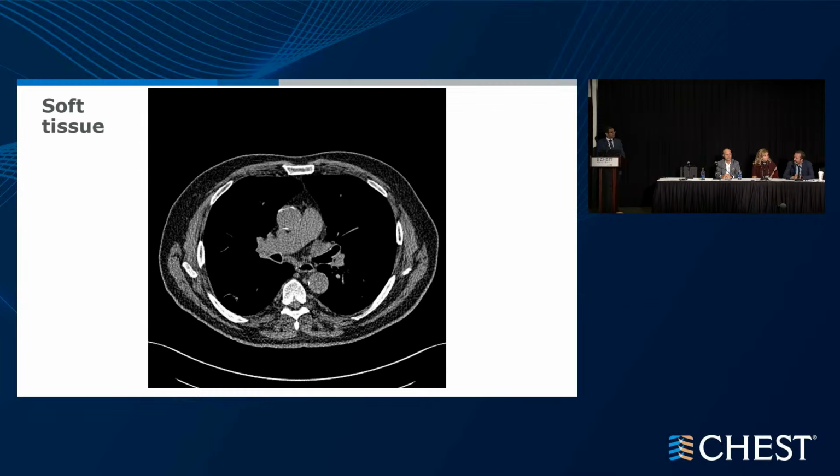The other thing I notice about these lesions is that they're morphologically not quite the same. So they're both pretty sizable lesions. And so in the absence of clear mediastinal disease, which we'll get into here, there's always a question of, are these synchronous primaries, or is this a metastatic case? Is this stage 4 disease? So we could potentially upstage this patient to stage 4 in a single procedure if you can prove that this is a metastatic process. The fact that they have different morphologies, I think, makes that a bit less likely.